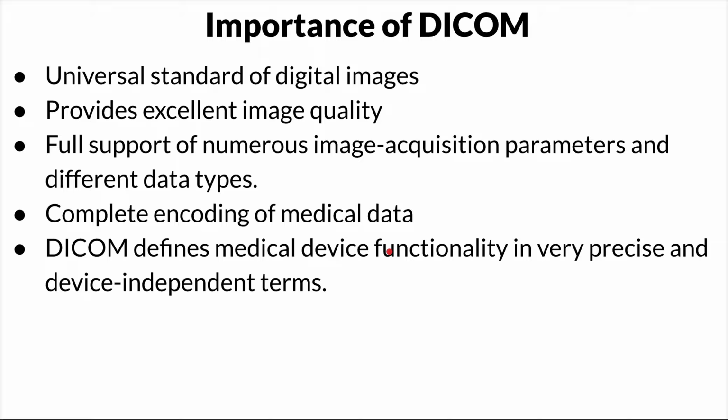So you already know that when you take the scan, DICOM can encode everything about the patient. Then, since it's encoding the data of the patient, it can also encode the medical devices that you use. Everything, we try to encode that also. So these are some of the reasons why DICOM is important.